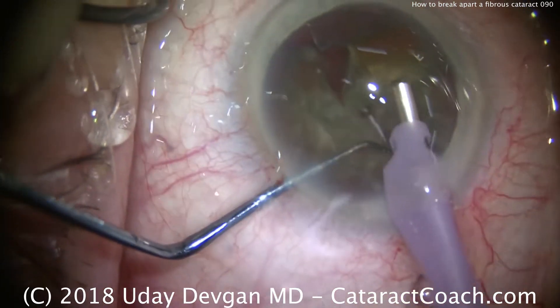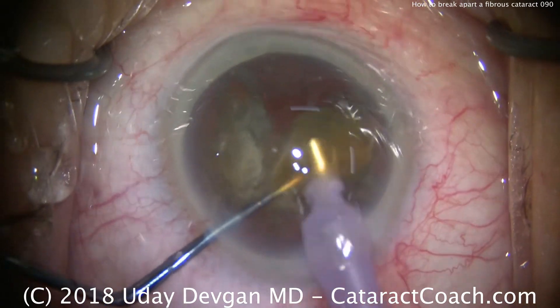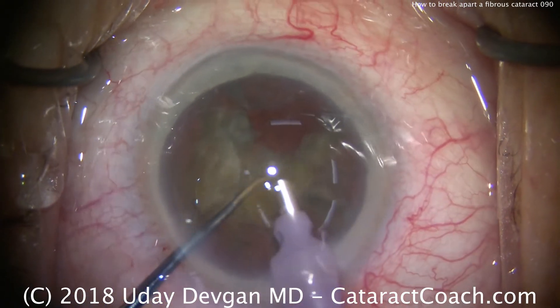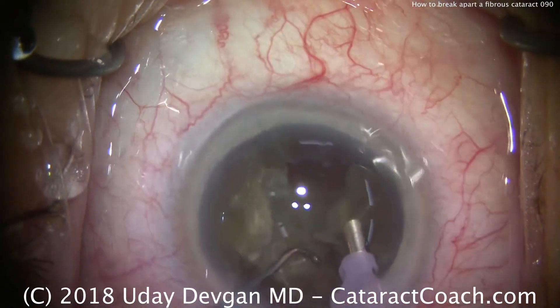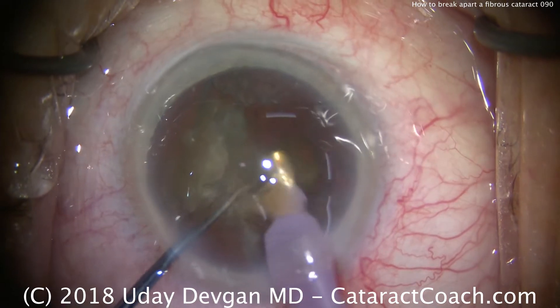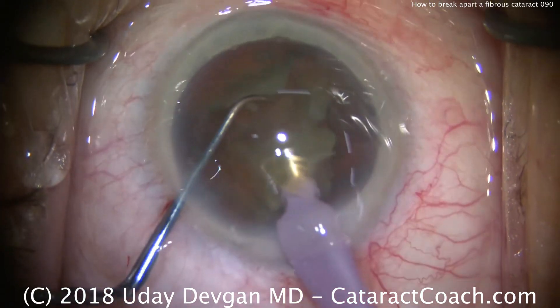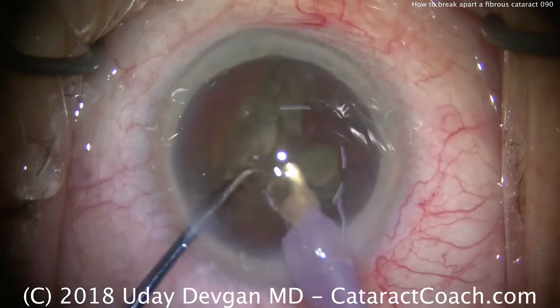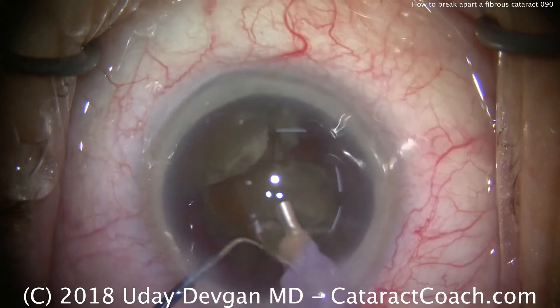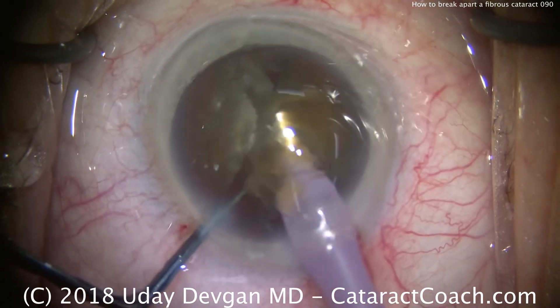Finally, we'll be able to get separation of one of these pieces. And as we can see, once that first piece is separated, we can bring it up to the iris plane and emulsify it with the phaco probe. Here's another piece brought up. The technique is: if you don't get the first chop propagating through the nucleus, just keep chopping smaller bits — rotate and chop, then repeat. Eventually you'll get the first piece to break off, and then it comes apart relatively easily.